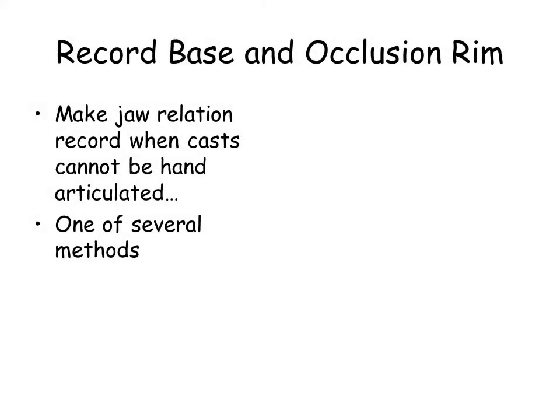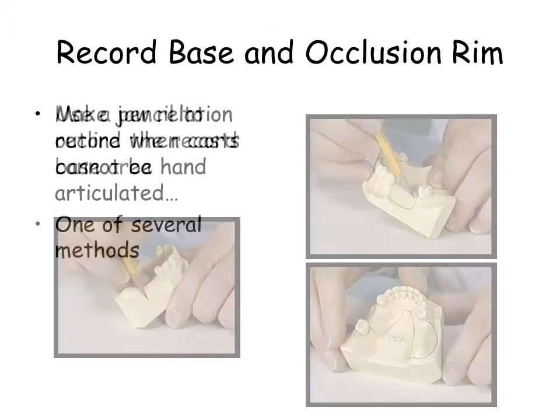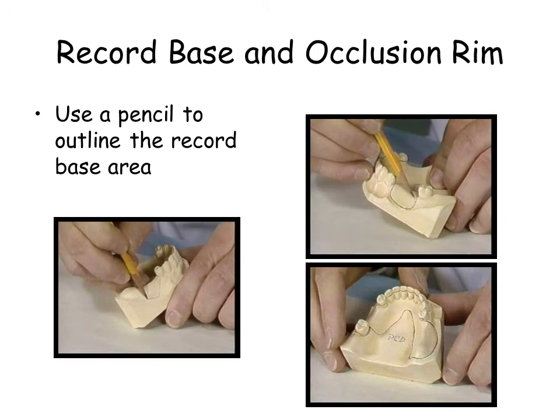When the patient casts cannot be hand articulated, a record base and wax occlusion rim may be constructed. Outline on the cast and pencil the extent of the record base, as seen in the illustration.